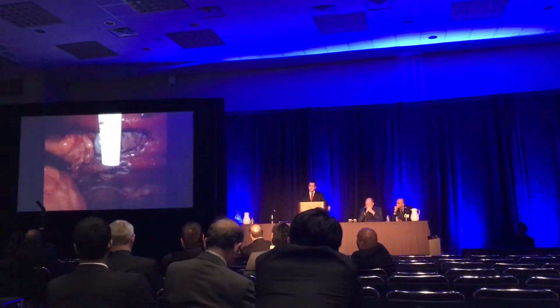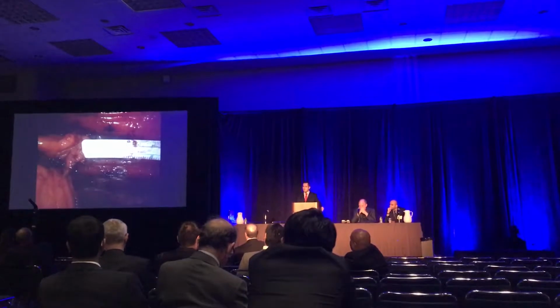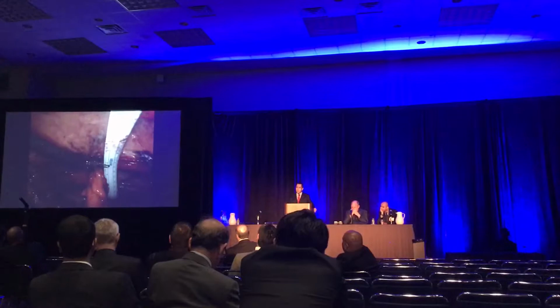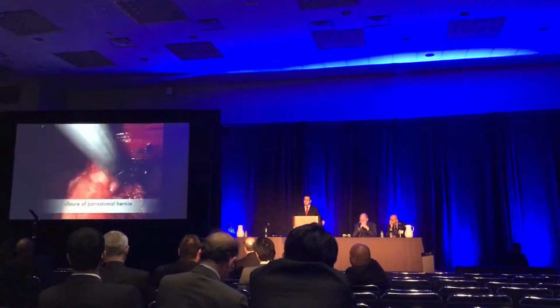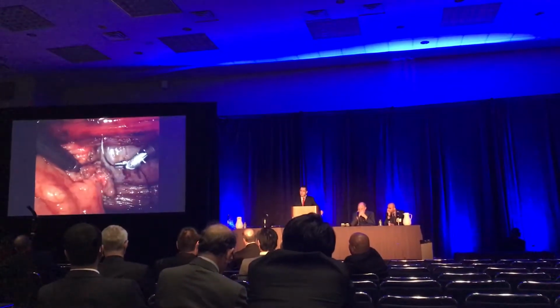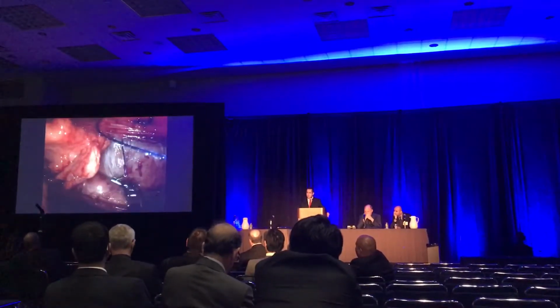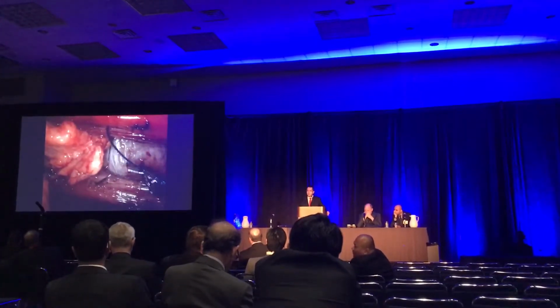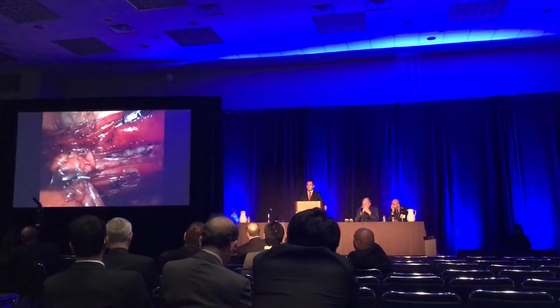Next, we take measurements of both of the defects for closing. Here you can see the very large midline defect that we closed. Closure is performed with a number 1 braided suture in a running fashion. Care must be taken to avoid making this closure too tight to prevent obstructive symptoms from the ostomy.